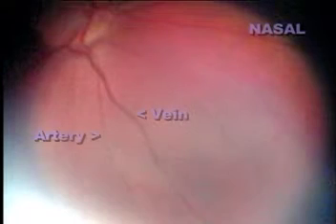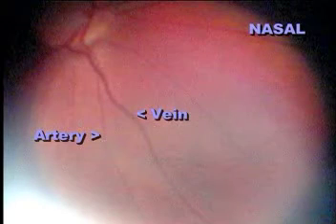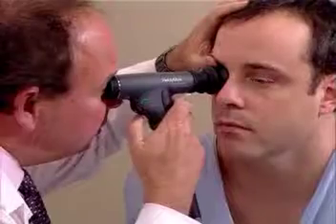The retinal vessels are evaluated as they arborize over the retina. The central retinal artery gives rise to 4 main branches that supply the superior and inferior aspects of the temporal and nasal quadrants of the optic fundus. And again, one will examine all of the quadrants as well as the macula in the standard fashion.